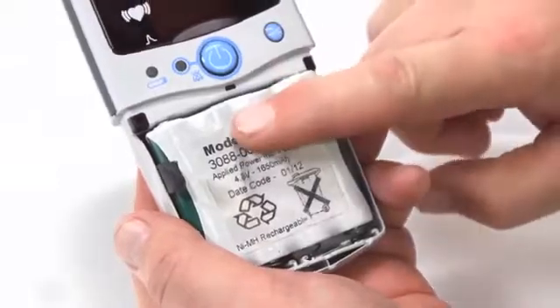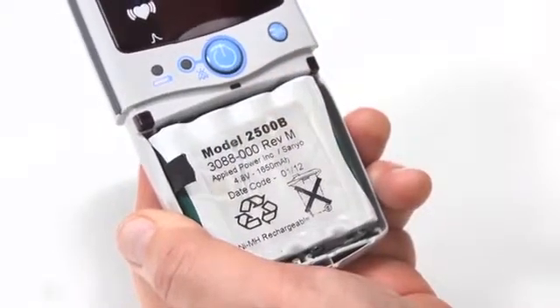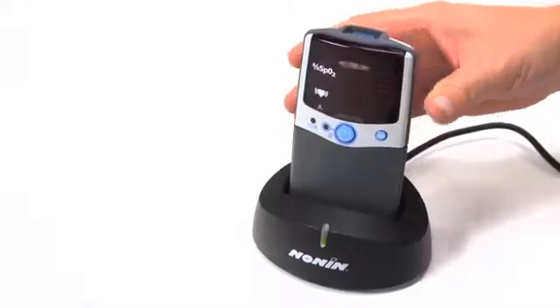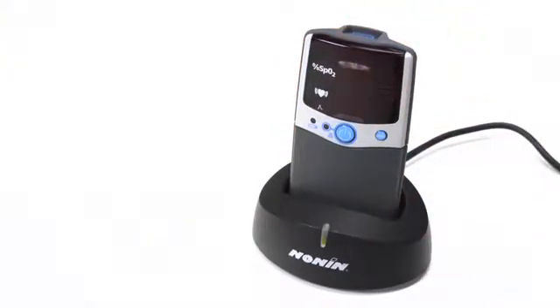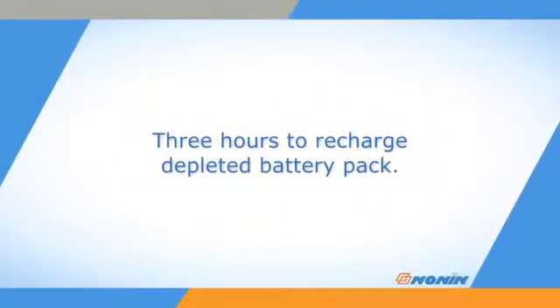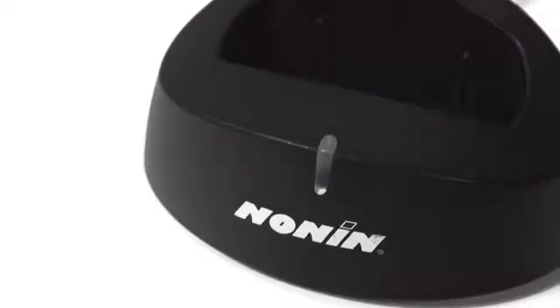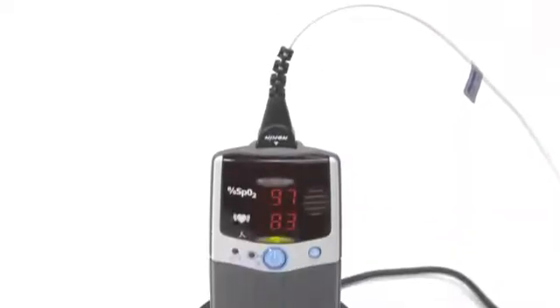Replace the battery cover so it clicks into place. A rechargeable battery pack may be in place in your Model 2500 oximeter. If so, you can recharge by placing the monitor in the Model 2500C recharger stand from Nonin Medical. Recharging takes about three hours when the battery pack has been completely depleted. The charger indicator will remain solid green while charging and flash when the battery pack is fully charged. You may leave the oximeter in the stand to maintain a full charge between uses, and you may also use the 2500 oximeter while it is charging.